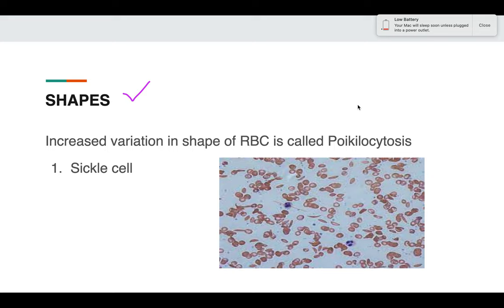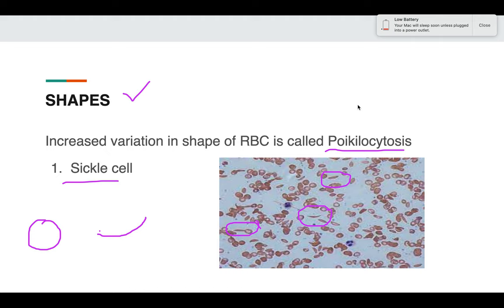Regarding shape abnormalities: if there is increased variation in the shape of RBCs, it is known as poikilocytosis. The first shape we discuss is the sickle cell, seen in sickle cell anemia. In the PBS you can see RBCs that have gone from a round shape and formed like a crescent — both edges will be sharp. This is known as sickle cell.